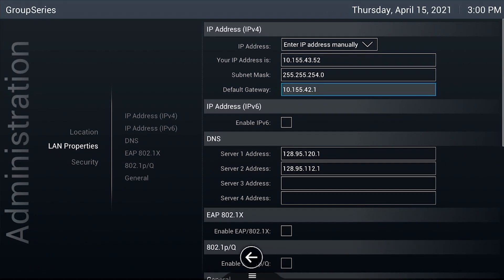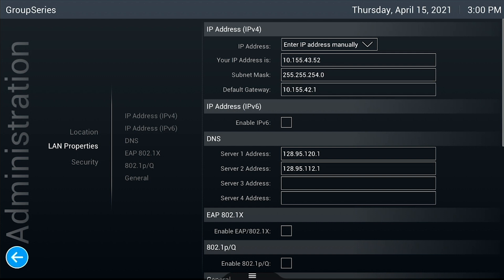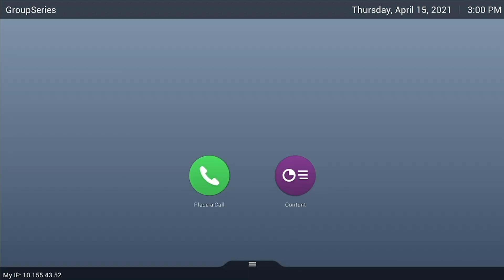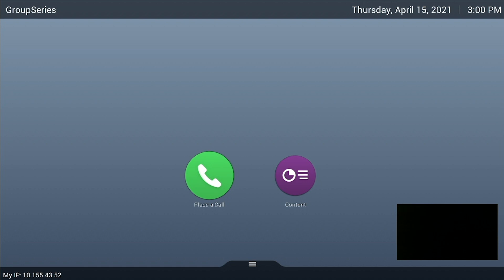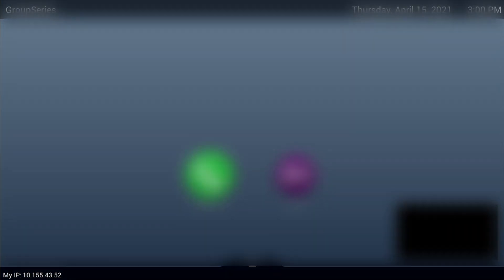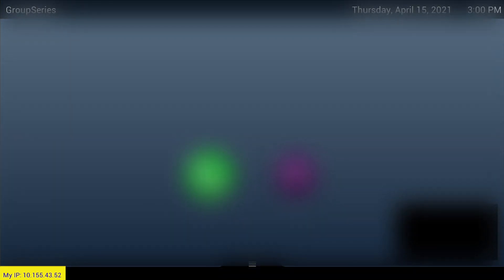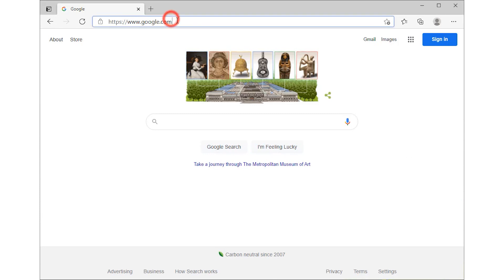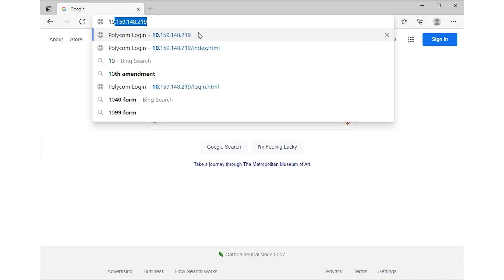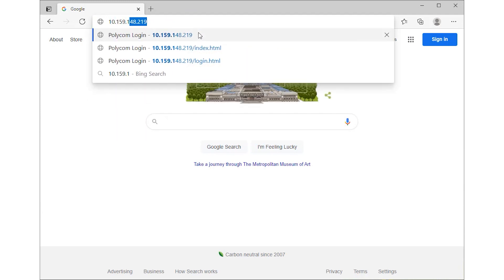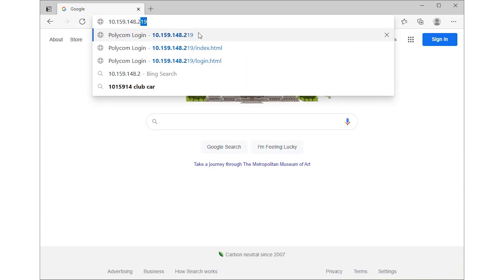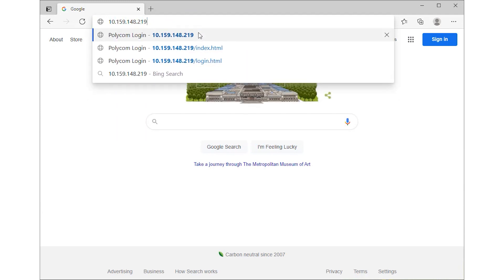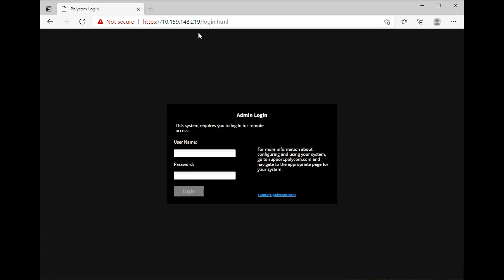To confirm that the Polycom unit is using the static IP, the My IP area at the bottom left of the main menu should reflect the static IP that was set. You can also try navigating to the web interface of the unit by entering the static IP address in the web browser of a computer or laptop connected on the same network. If the web interface loads, you have successfully configured a static IP on the Polycom unit.